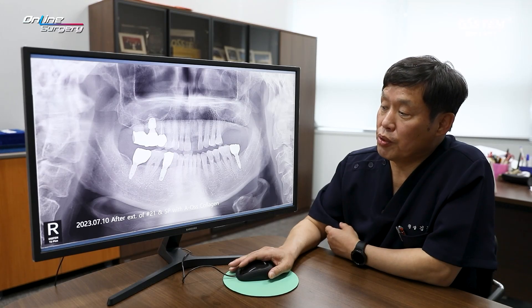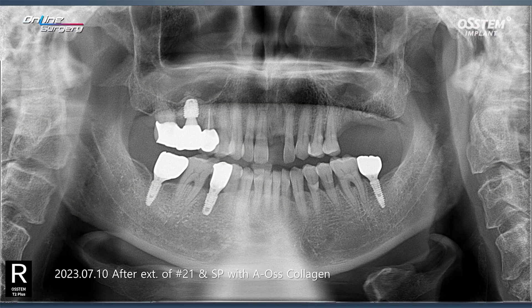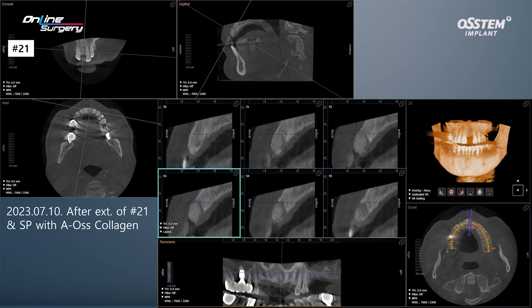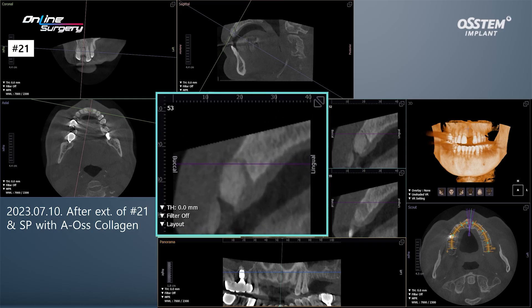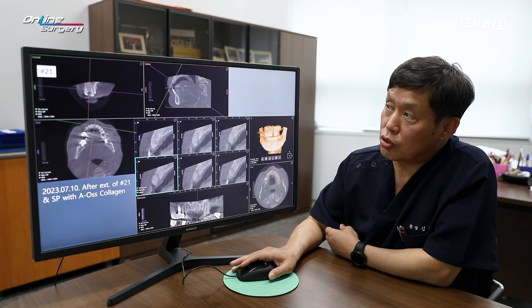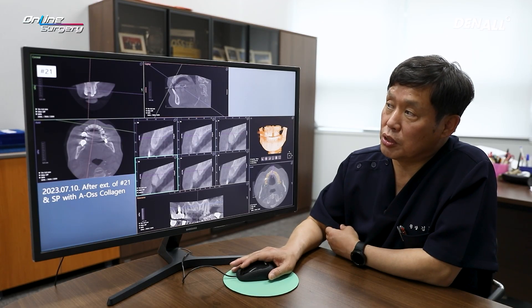After extracting number 21 and applying AOS collagen for socket preservation, we took a panoramic X-ray. This is the CBCT data right after the surgery. The palatal bone also shows some resorption. However, since the labial bone is completely missing, we prioritized preserving the soft tissue in that area by using AOS collagen for socket preservation.